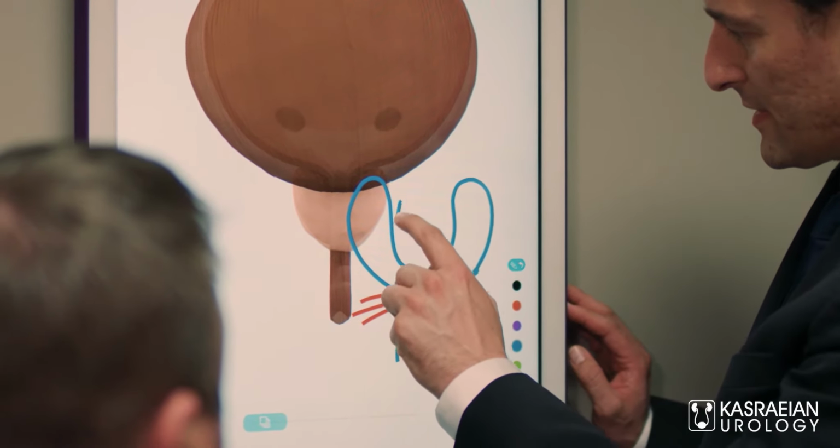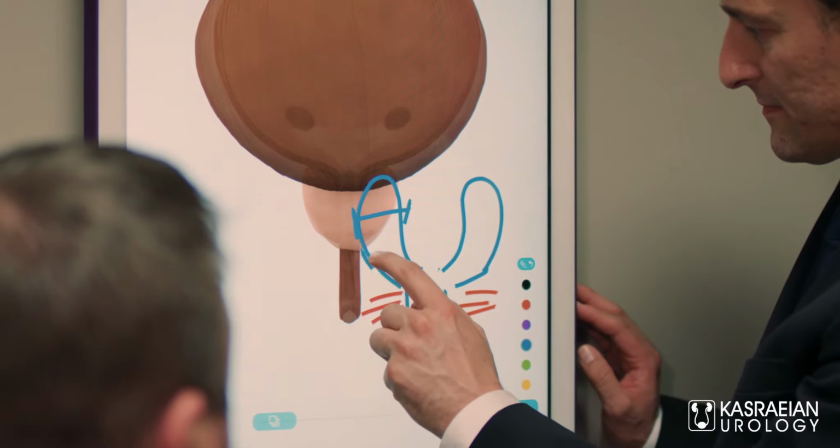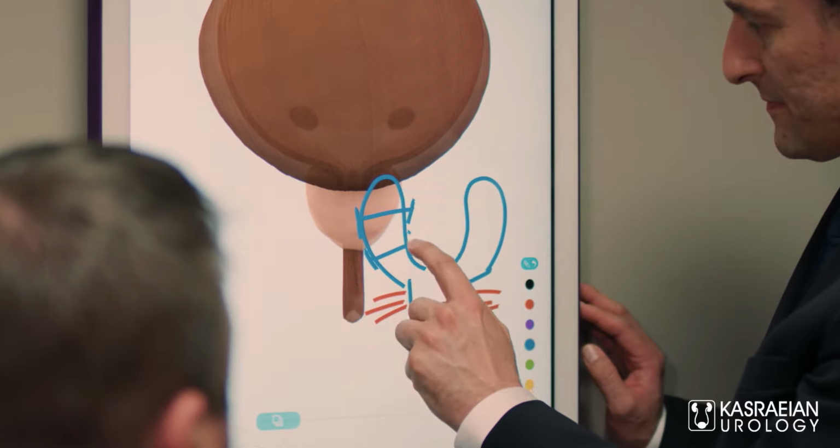So Urolift is a wonderful, minimally invasive way of managing BPH. Instead of removing the tissue, you basically use a suture in between two clips in a very quick cystoscopic procedure to put pressure on the inner lobes of the prostate that are causing the obstruction and essentially secure them out of the way, kind of like opening up the curtains to look at a stage, for example. It's very minimally invasive, it's very effective, and patients do very well with it, both in terms of outcomes from a urination standpoint, but in terms of a recovery from a very minimally invasive outpatient procedure.